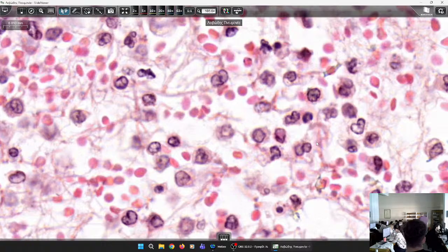When we have the endothelial cells activation, they form gaps. So fibrinogen passes through the lumen to the tissues, and it's polymerized, and we see it as fibrin. And if this exudate is organized, it forms strictures.